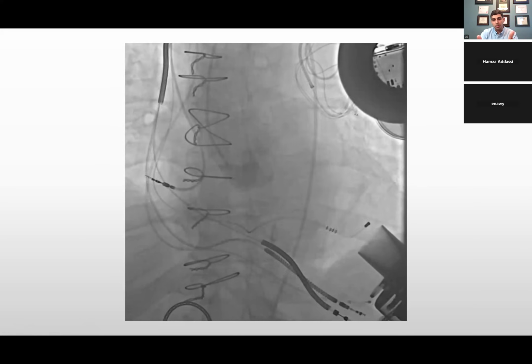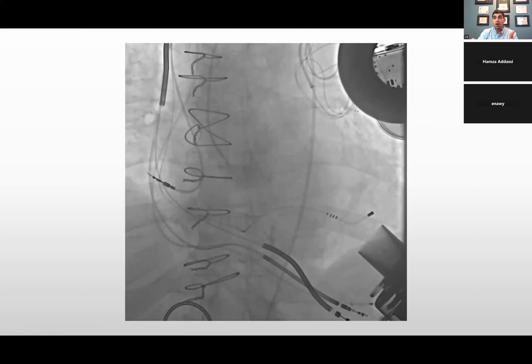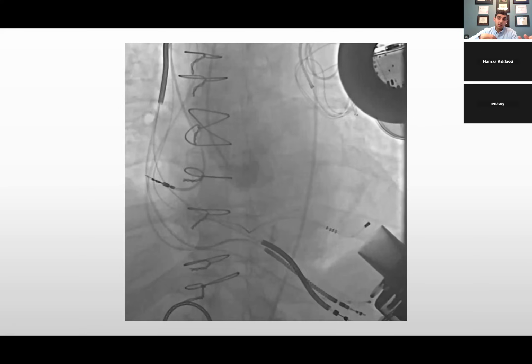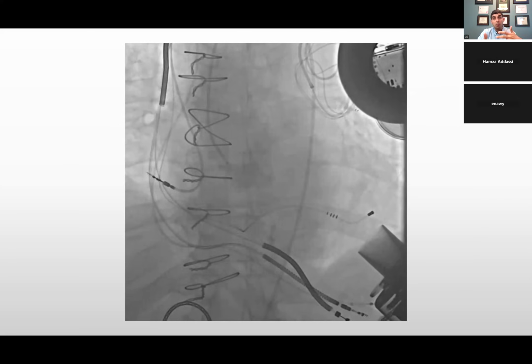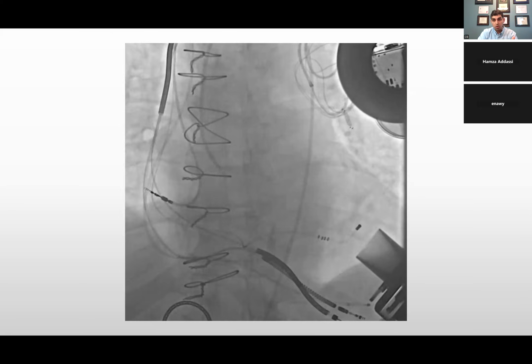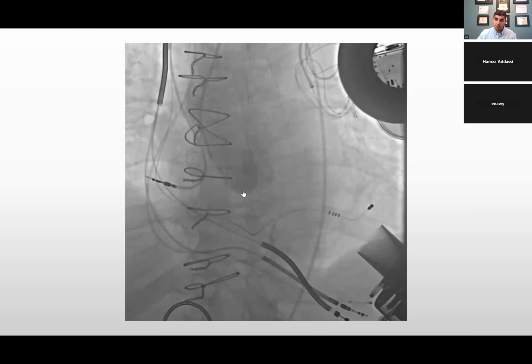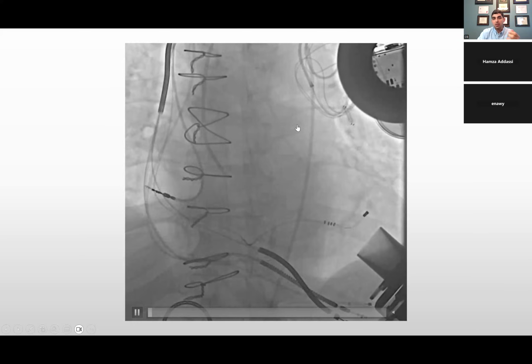So I know, in Jordan we don't have this, but this is what this is. This is called a HeartMate. So there are people in the world that are walking around with pumps that are connected to their heart, and then a tube that just shoots the blood back into the aorta. And they have a battery. They have a couple batteries, because if the battery dies, that will be bad. The pump will stop, people will die. So this is an example of a patient who's had open heart surgery, and they did a pump. He's end stage. So this patient, there's nothing to be done for.